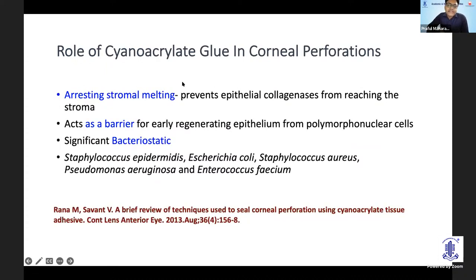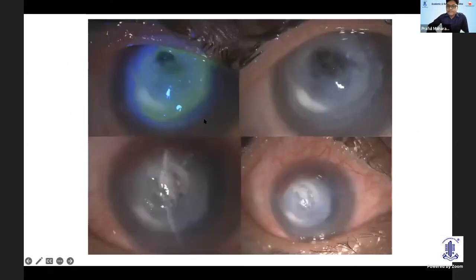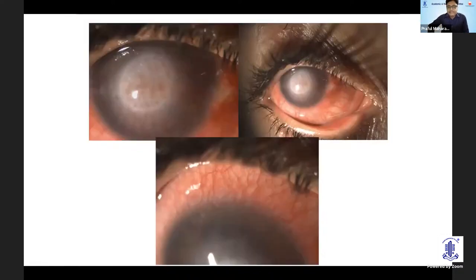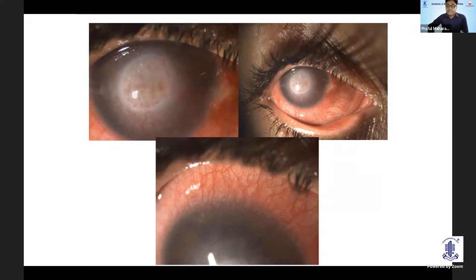The other advantages of cyanoacrylate glue compared to tenon's: it has some effect in preventing stromal melting and also has some bacteriostatic effect for organisms like Staph, E. coli, and Pseudomonas aeruginosa. These are post-procedure pictures of glue BCL. This was a post-CXL keratitis patient which healed well, but notice the vascularization. The surface of the glue is always irregular, and if your BCL dislocates it's very likely that the patient will develop papillary conjunctivitis. One patient healed but you see the amount of vascularization induced — at times there may be active infection and you may not be able to give steroids postoperatively.